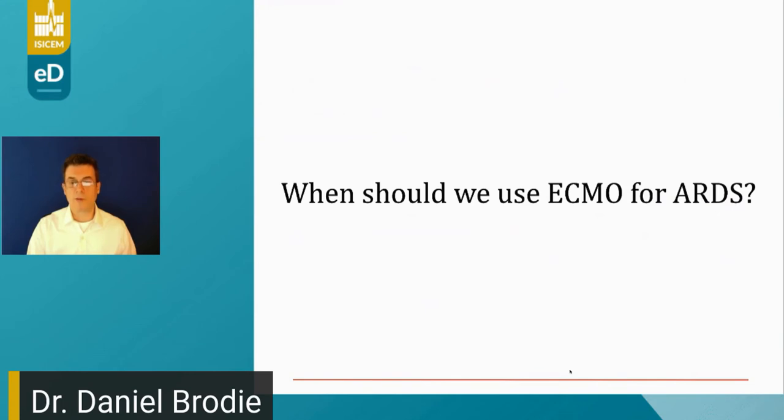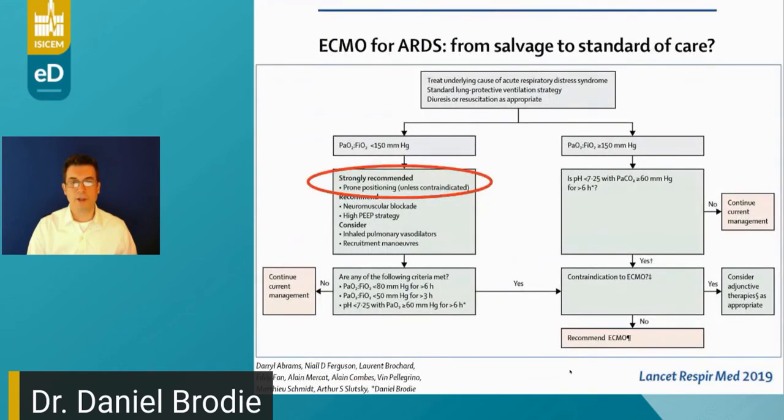So when should we use ECMO for ARDS? Well, we should use it as part of the standard ARDS management algorithm. Ultimately, we must treat the underlying cause of ARDS, use the bedrock principle, which is lung protective mechanical ventilation, diurese or resuscitate as appropriate, and then in the PaO2/FiO2 less than 150 group, prone positioning is strongly recommended unless contraindicated.